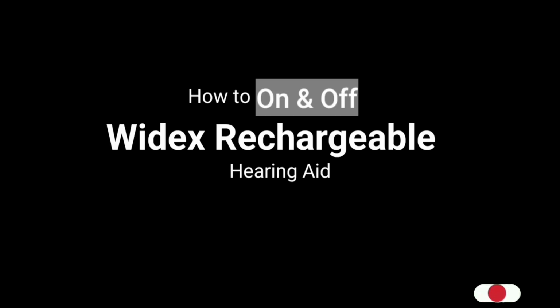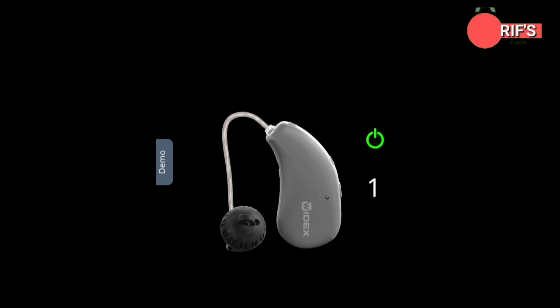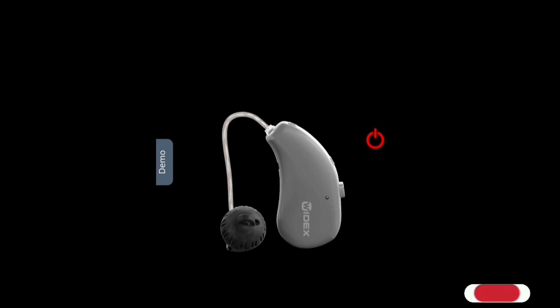Let me explain how to turn on and off a Widex rechargeable hearing aid. Every Widex rechargeable hearing aid has one button on top called the universal button. With that button you can switch off and switch on the hearing aid. To switch it on, press and hold that button for more than 3 seconds. It will get turned on, which means it gives a green light.